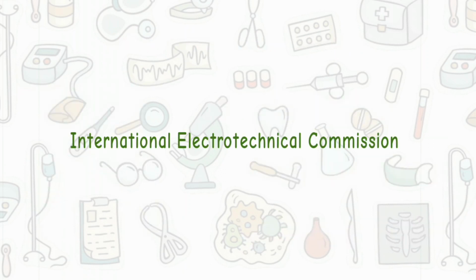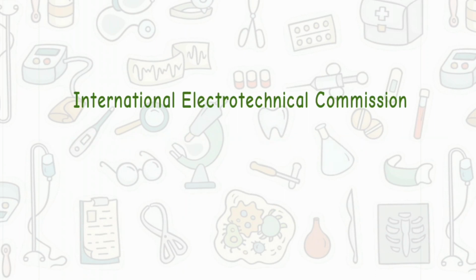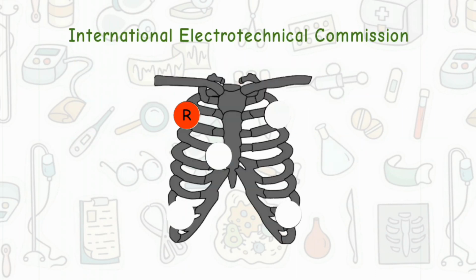Now, let's discuss how to place ECG leads according to the International Electrotechnical Commission color code system. Red lead to right upper area of the chest, black lead to right lower area of the chest, yellow lead to left upper, and green to left lower area, finally white to the middle area of the chest.